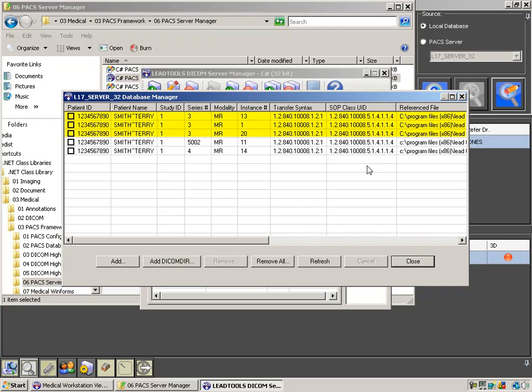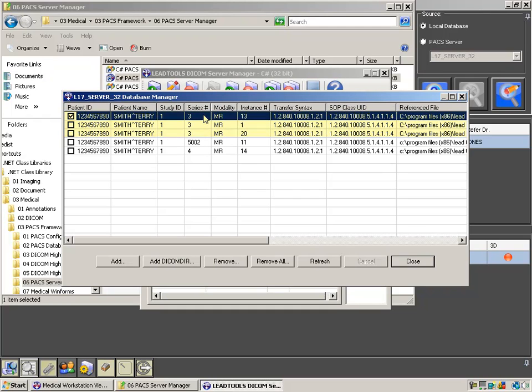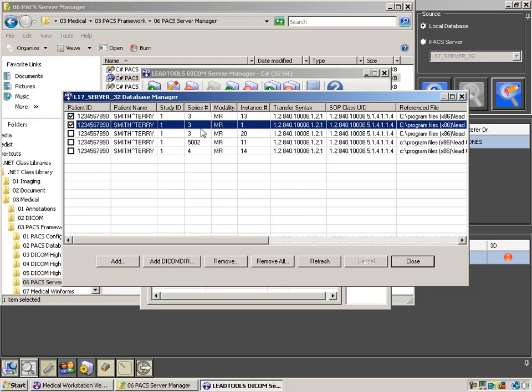Here, you'll see the images we just stored to this server. Check each one and click remove.